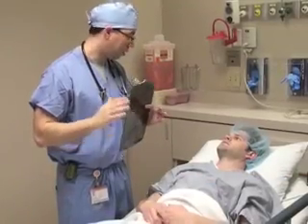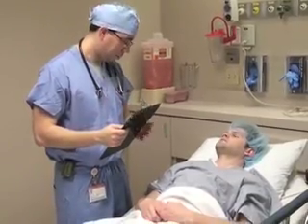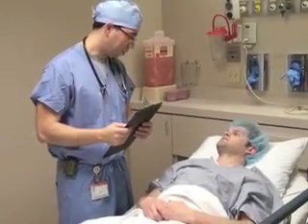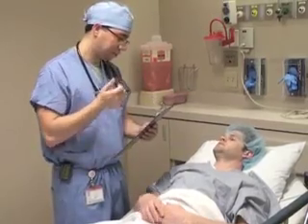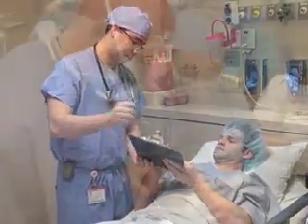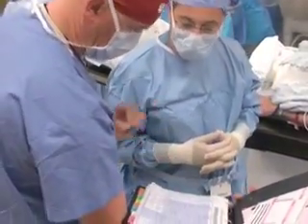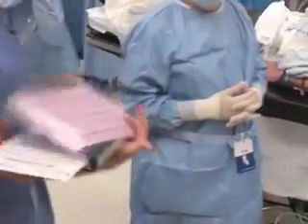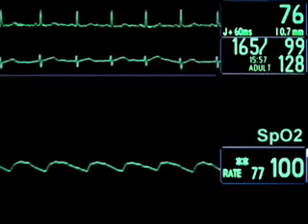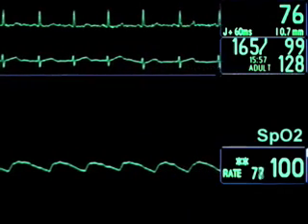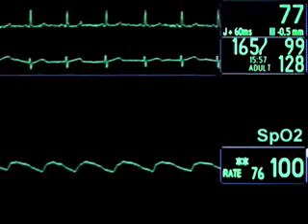When possible, explain the procedure to the patient and obtain written informed consent. Complications such as infection and bleeding should be discussed. A procedural timeout and checklist must be reviewed before you start the procedure. Continuous electrocardiography and pulse oximetry monitoring should be maintained throughout the procedure.